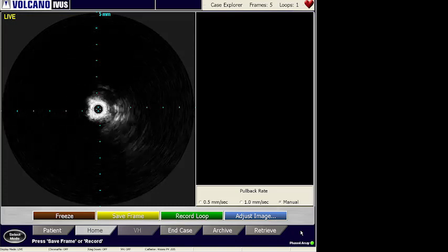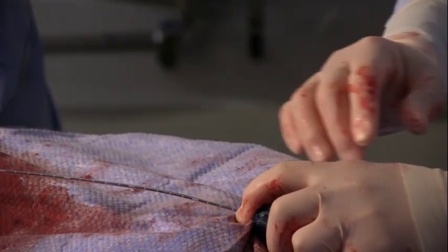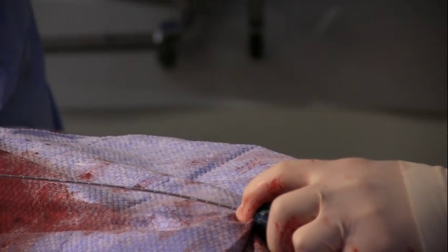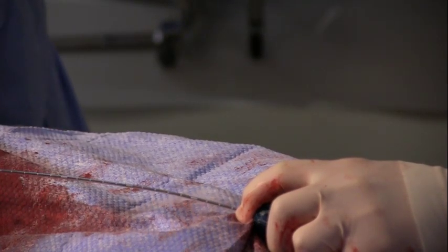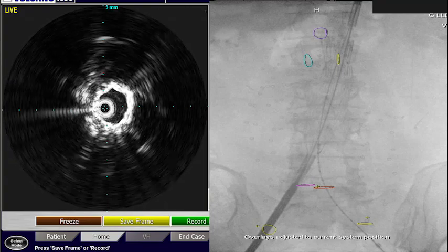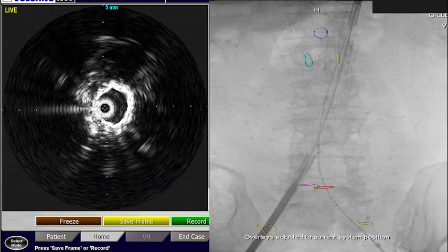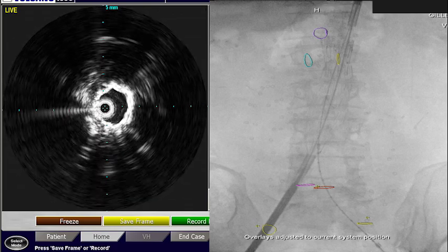Advancing the IVUS catheter is a surefire way to see the contralateral wire as it enters the contralateral limb, providing precise visualization of the location of the wire in relation to the contralateral limb. With the Lundequist wire in the contralateral gate, pull back on the IVUS catheter to align the IVUS markers with the flow divider marker to assist in measuring the length of the iliac artery. The iliac artery length will determine the length of the contralateral limb.